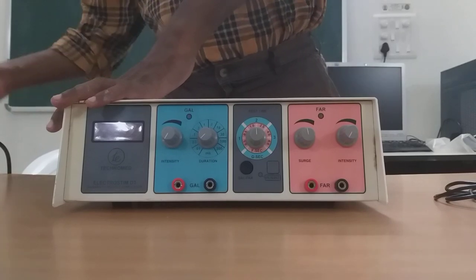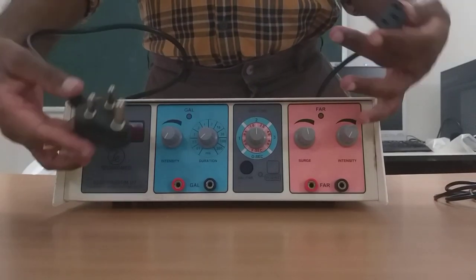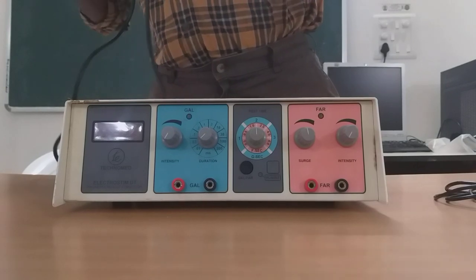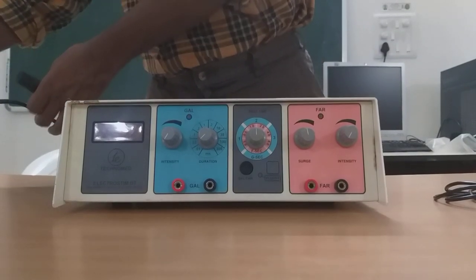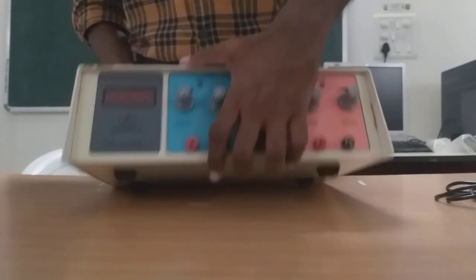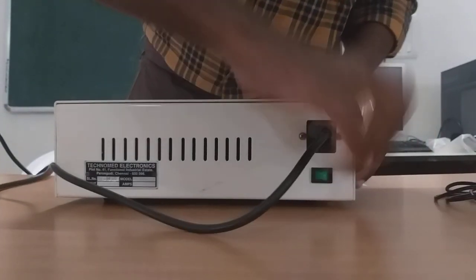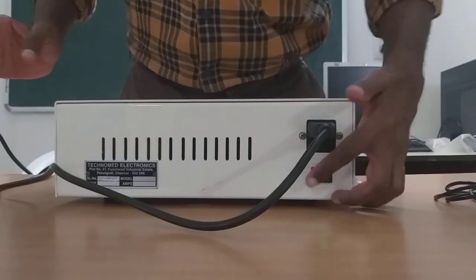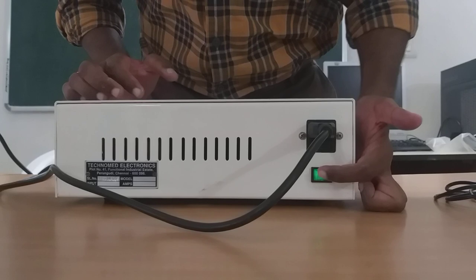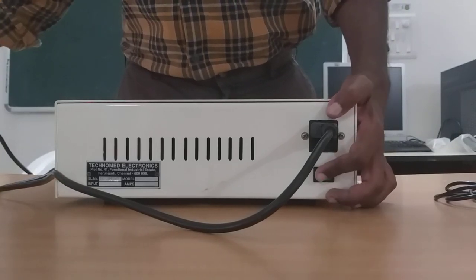To start with, this is the power cord. The power cord requires 5 amperes. There are certain equipments in physiotherapy like shortwave diathermy which requires 15 amps, and you can see at the back of the machine where the power cord goes in. Once you switch on, you can see that the green light goes on, meaning the supply is there for the stimulator.